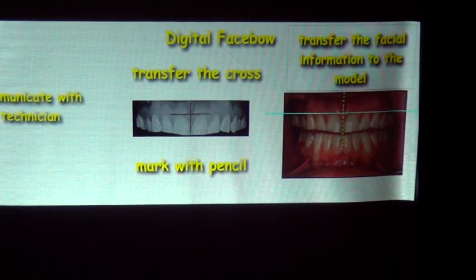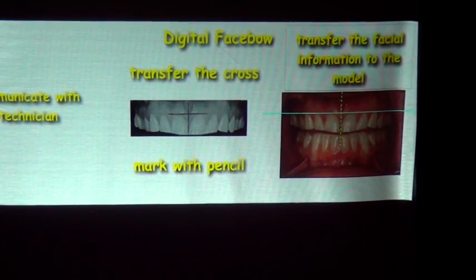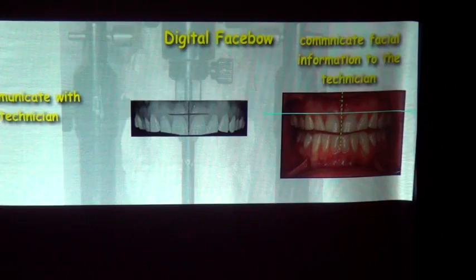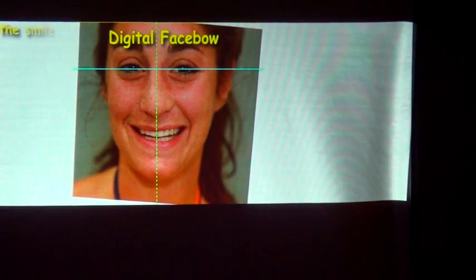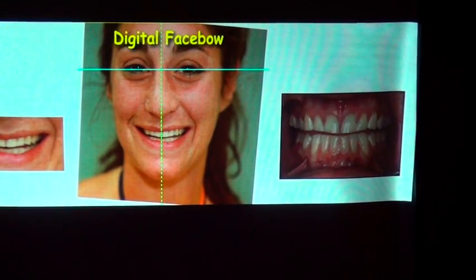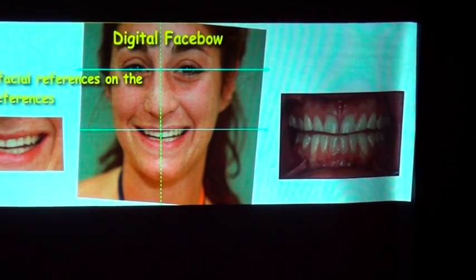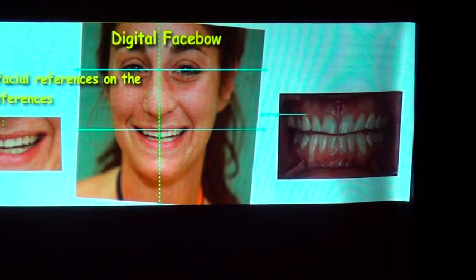And now we've communicated with our laboratory where this cast gets mounted, with a facial reference as information to give us that mounted. So we can mount it, and so we're basically seeing the facial references on the intraoral and the smile views.